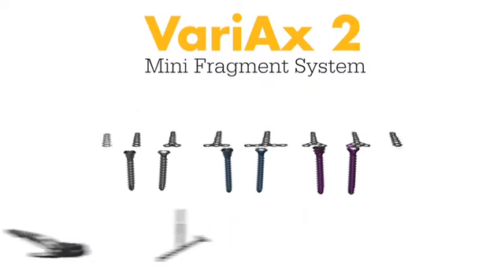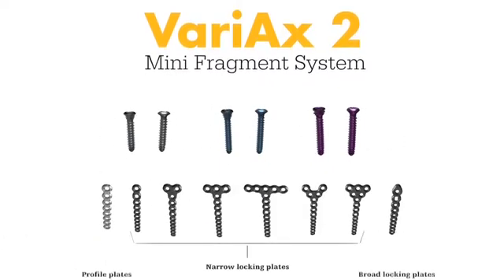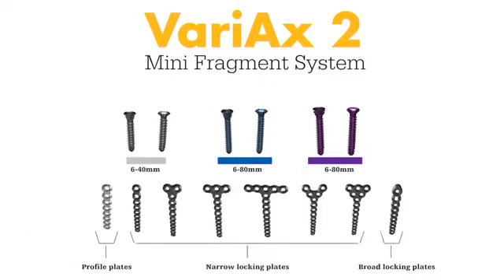The system features a full range of low-profile mini fragment plates and a complete range of screw options and lengths in 2.0, 2.4, and 2.7 millimeter modules.